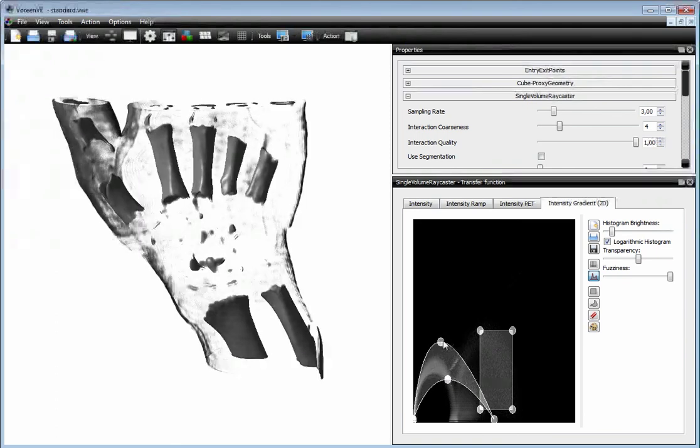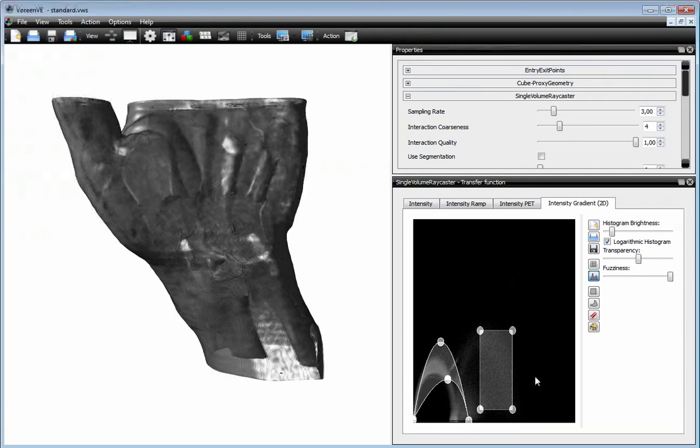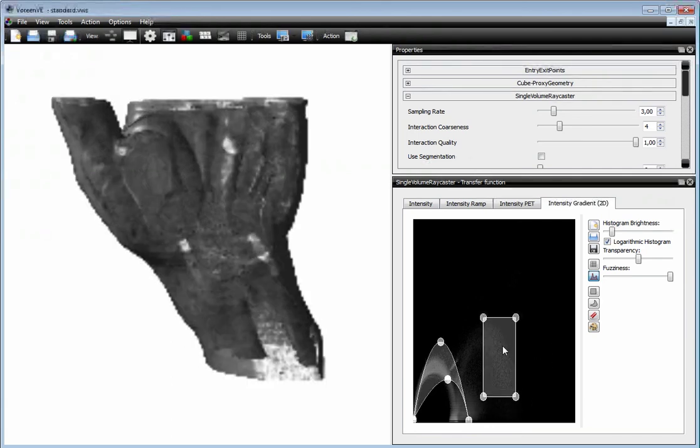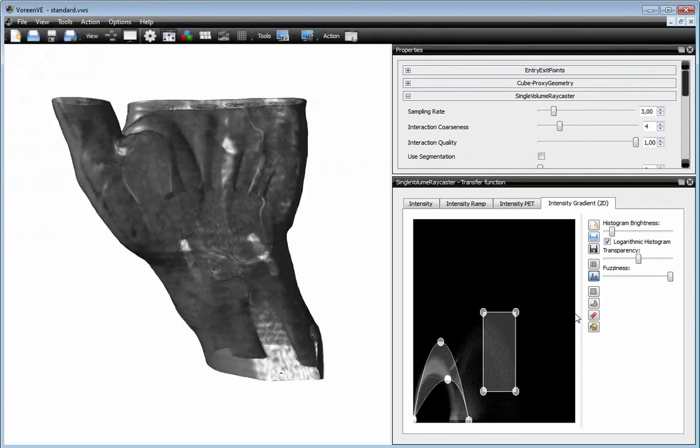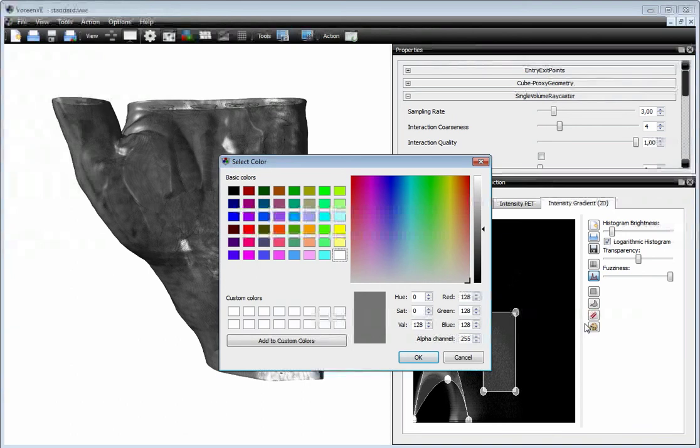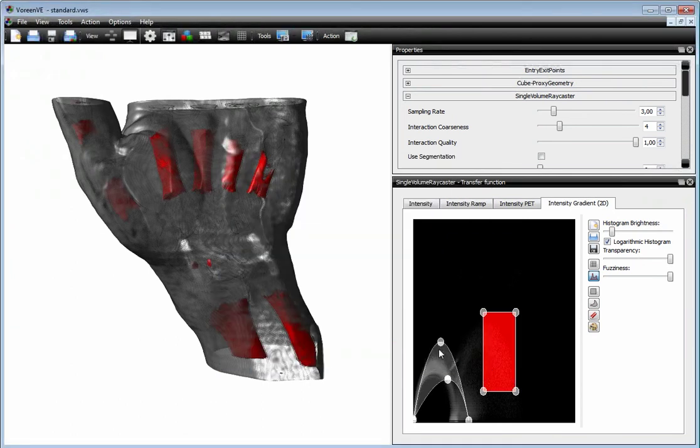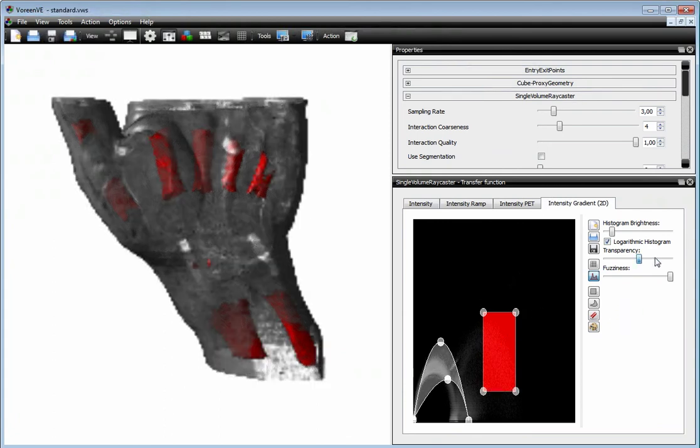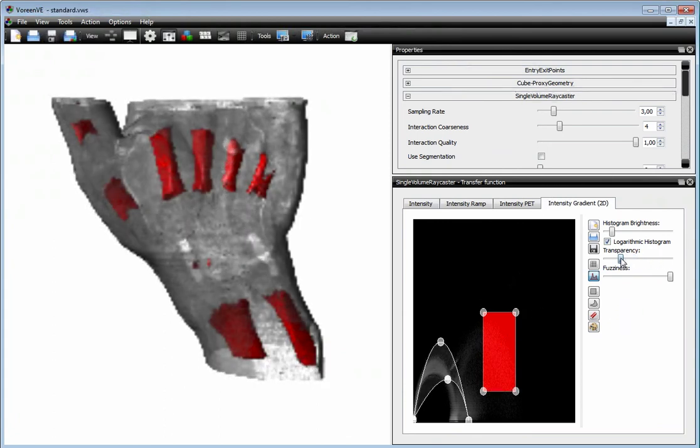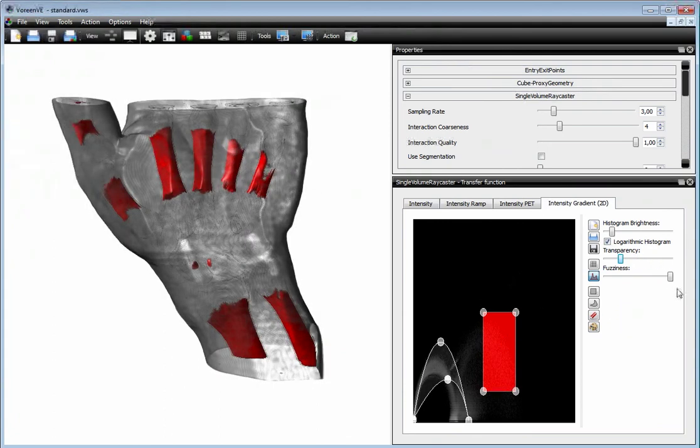With each of these primitives, you can assign a color, and you can also assign transparency, as you can see, and find the next one.